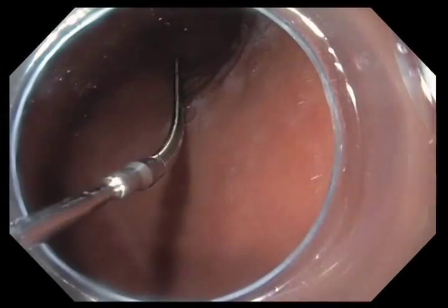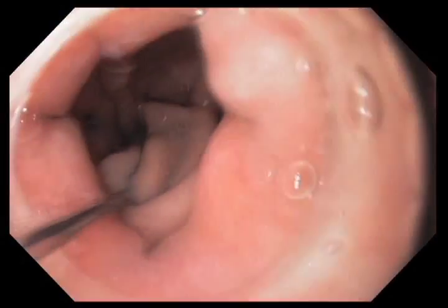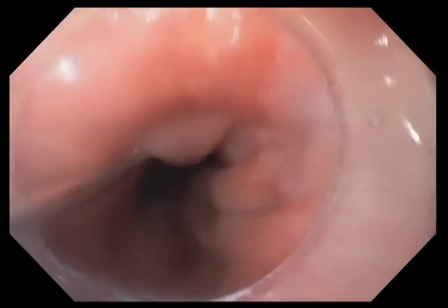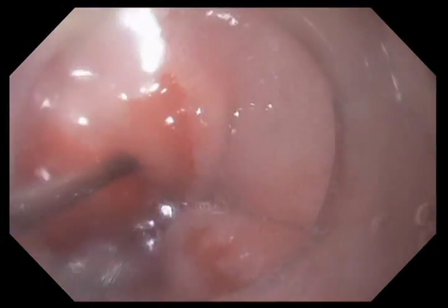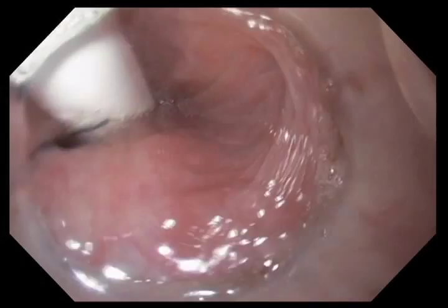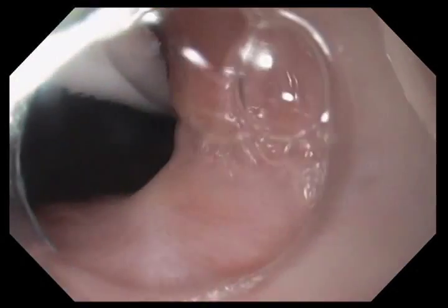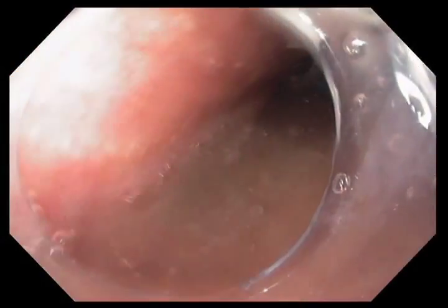We're now passing a Savary guide wire. The first thing we did over this Savary guide wire — which we don't show in the video — is to pass a balloon. That balloon inflates to a certain pressure and essentially measures the diameter of the esophagus. Once we determine the diameter of the esophagus, we choose a treatment balloon of that diameter. We're now passing the endoscope alongside the treatment balloon catheter that's been placed over the Savary guide wire.